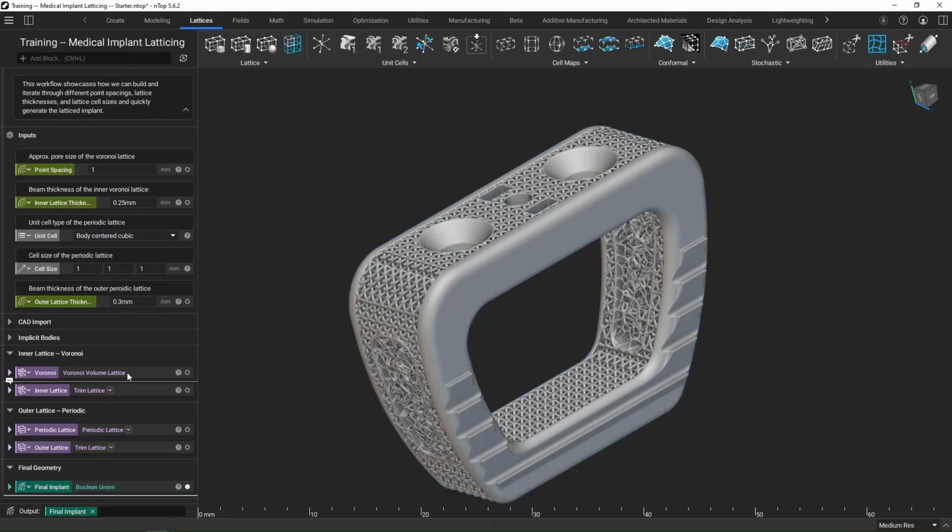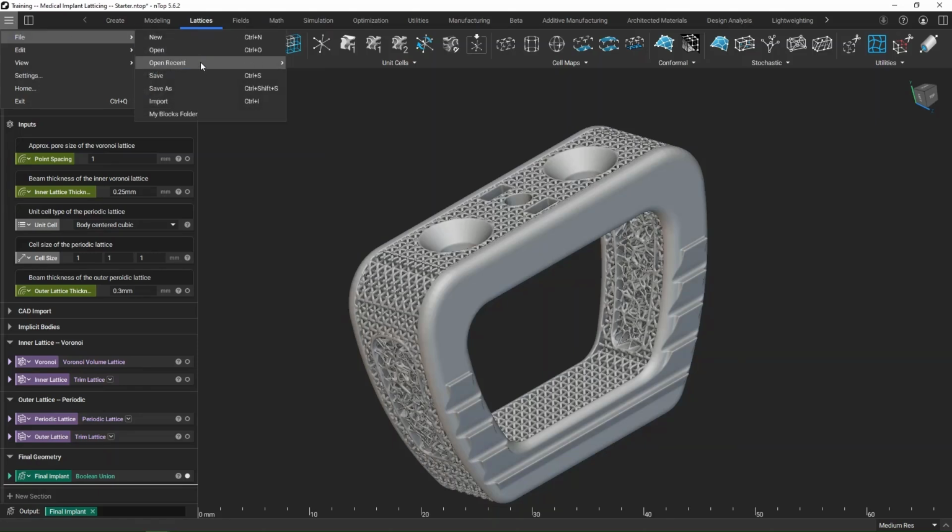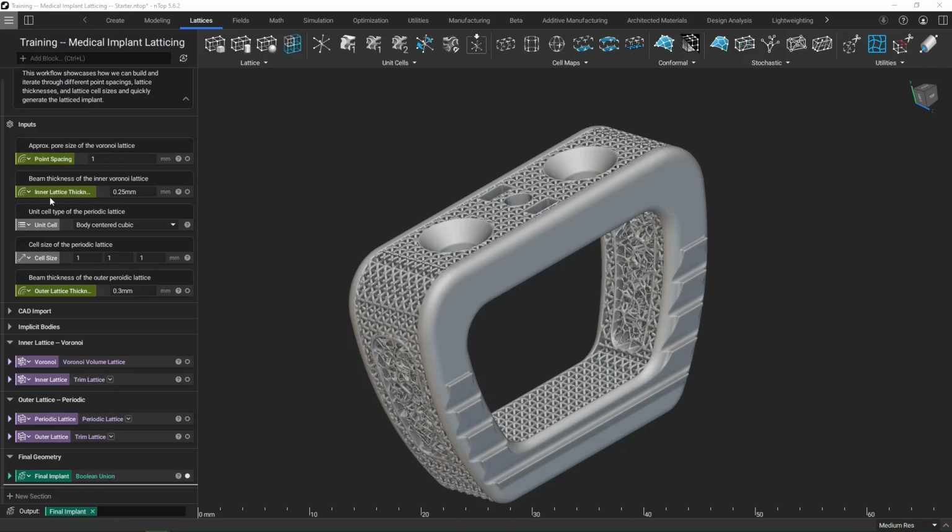And so this is looking good for me. I'm going to go ahead and save this. So I'm going to click on these 3 lines up here, File, Save As. I'm saving it in my file directory outside of this window right here. But I'm just going to go ahead and call this my medical implant latticing.